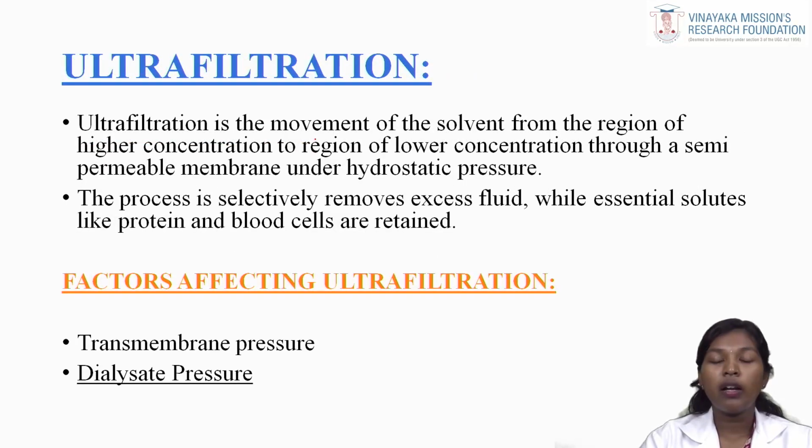Ultrafiltration. Ultrafiltration is the movement of solvent from the region of higher concentration to the lower concentration through the semi-permeable membrane under hydrostatic pressure. In diffusion there is removal of solute, such as urea, creatinine, potassium, etc. But in ultrafiltration it is the removal of excess fluid. In ultrafiltration we remove the extra fluid from the body.